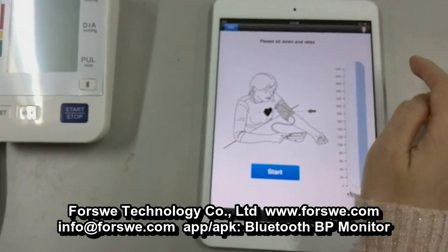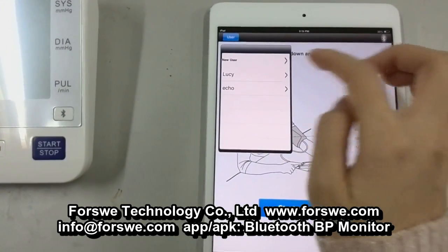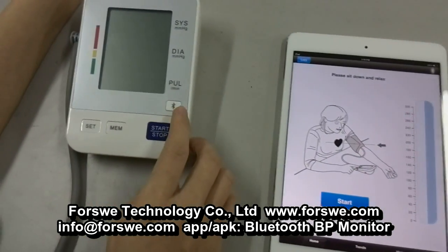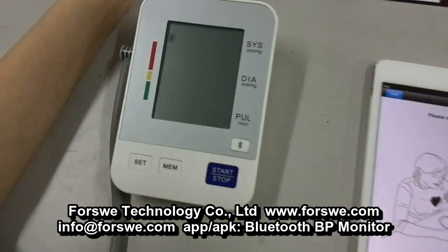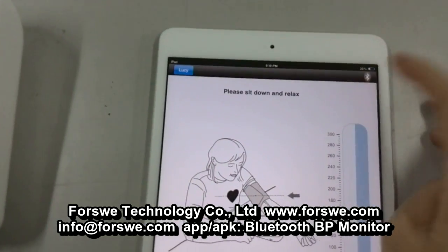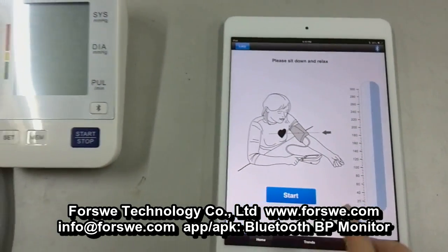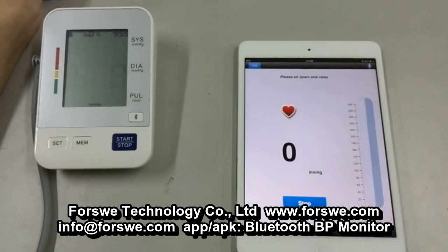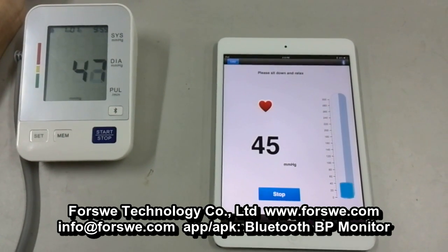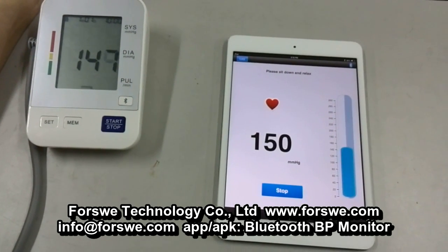Before the measurement, you have to choose a user account, and then connect it to the Bluetooth. Make sure the Bluetooth logo is lit on. Then click the button Start. Now it starts. During the progress, you have to sit quietly and make sure to relax.